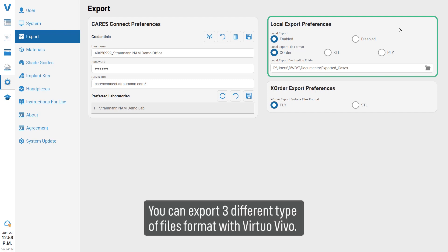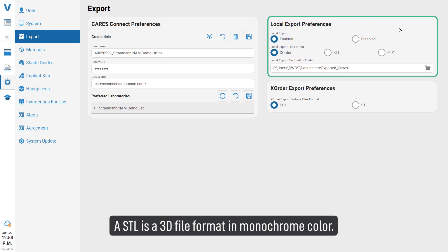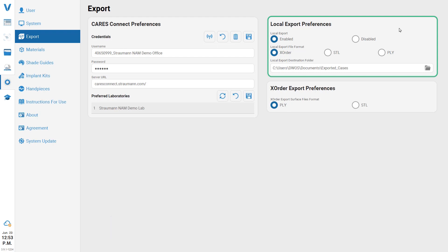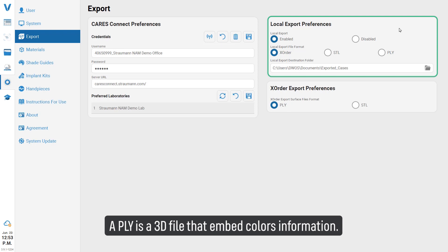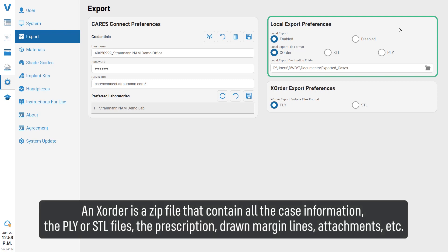You can export three different types of file formats with Virtual Vivo. A STL is a 3D file format in monochrome color. A PLY is a 3D file that embeds color information. An X order is a zip file that contains all the case information, including the PLY or STL files and the prescription.